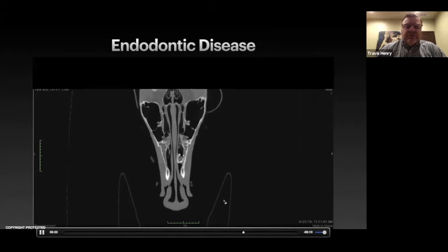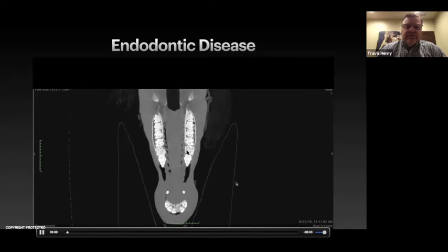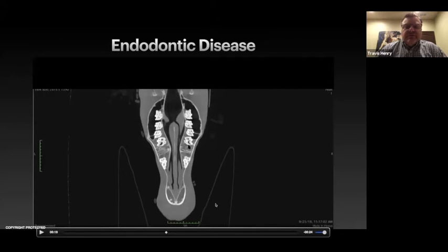So what was really going on with this patient was there was a separate center of dental material, and you can see how the roots are ending here of the 6 and the 7. And the other thing I want you to notice, if we jump forward a little bit, is the infundibula of these teeth, how big and gas-filled they are. Remember, only 11% of the infundibula will be normal. So we're going to find a lot of gas and openings in infundibula. And the trick is figuring out, is the apex in trouble? Is that breaching through to a pulp horn? And so forth. So CT is really, in my opinion, probably the only good way to evaluate whether an infundibular caries is causing your problem.